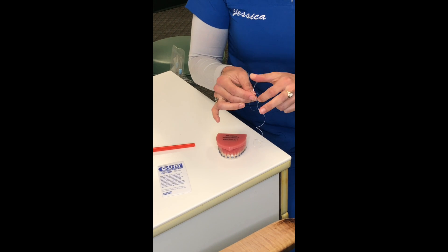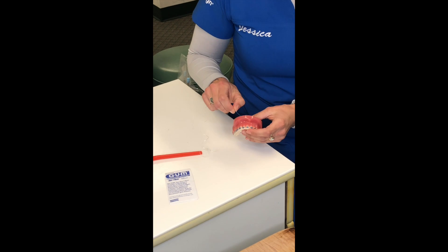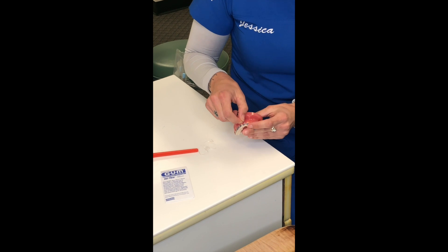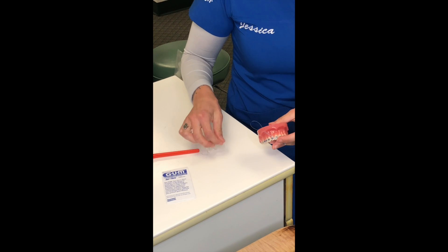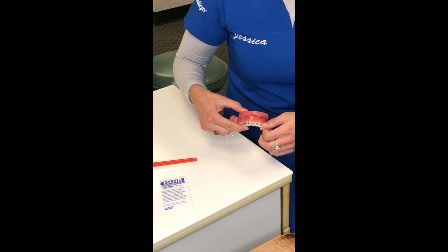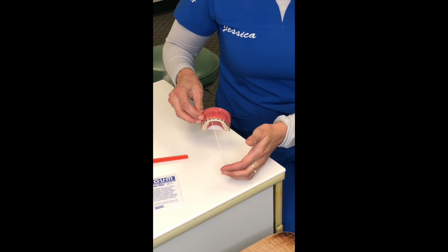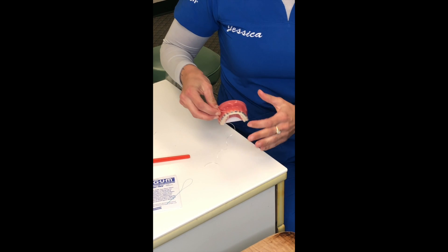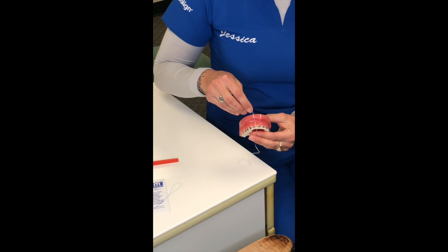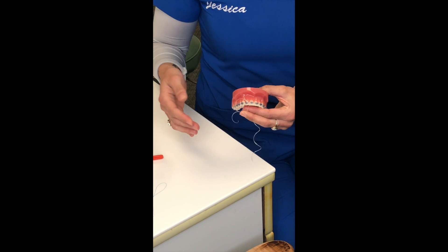What you do is take a regular piece of floss, thread it through, take the hard plastic tip, and you're going to go under the wire. Pull your floss through like this, hold on to one side, and then continue pulling the floss. Now your floss is under the wire and you can get close to your gum lines.